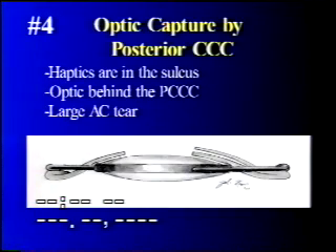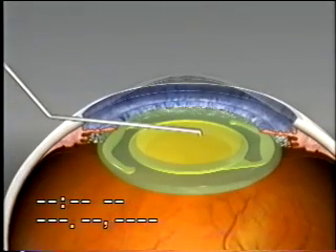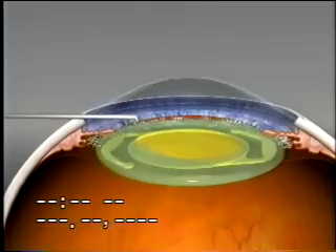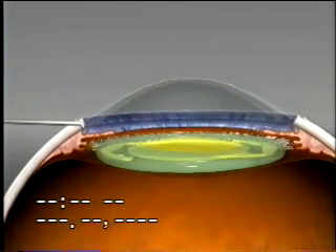The fourth option: the haptics are in the sulcus, and the optic is captured by the posterior capsulorexis. This can be utilized in the event of a very large anterior capsule tear making bag fixation unstable. The PCCC again has to be a little smaller than the optic, but the optic can be pushed through the anterior opening and posterior capsulorexis to obtain capture, fixation, and stabilization of the intraocular lens.